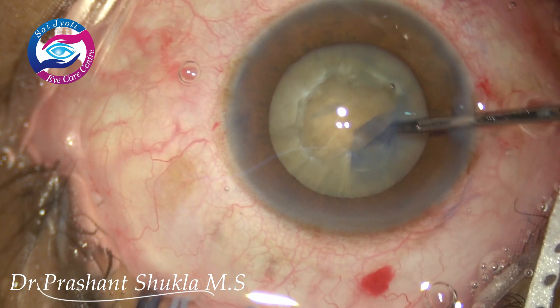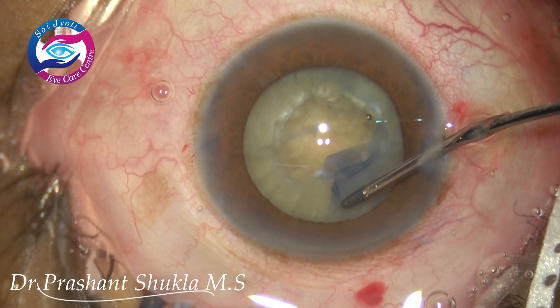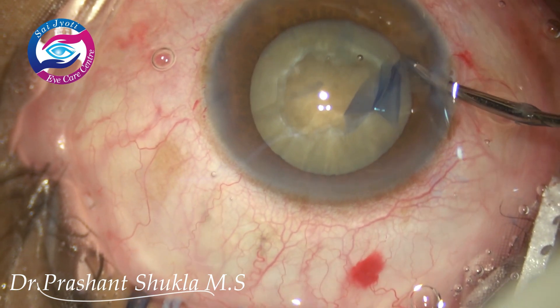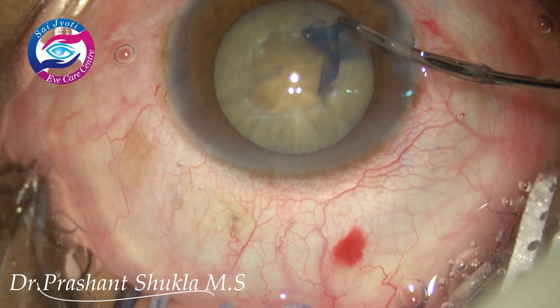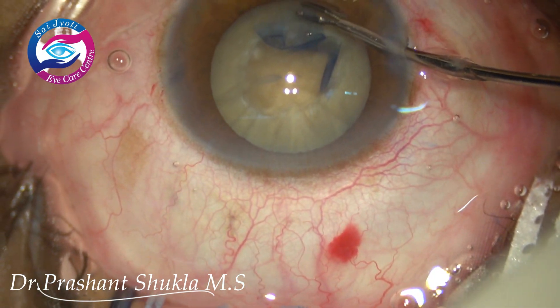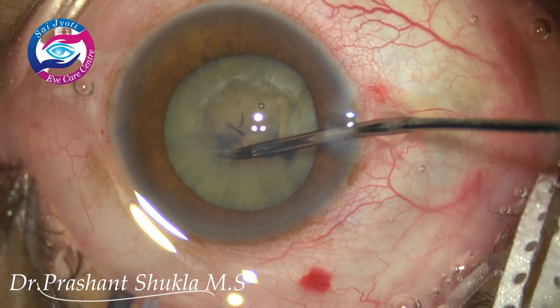Although we did not get a very good stain because when I instilled the trypan blue dye the pupil size was smaller than it is now. I am slowly moving the capsular flap along the pupillary margin. In SICS, if we have a small rhexis then nucleus management becomes very difficult, so I am planning to have at least 5 to 5.5 or even 6 millimetres capsular opening. The beauty of using a micro rhexis forceps is that it can be manoeuvred in any direction even from the side port.